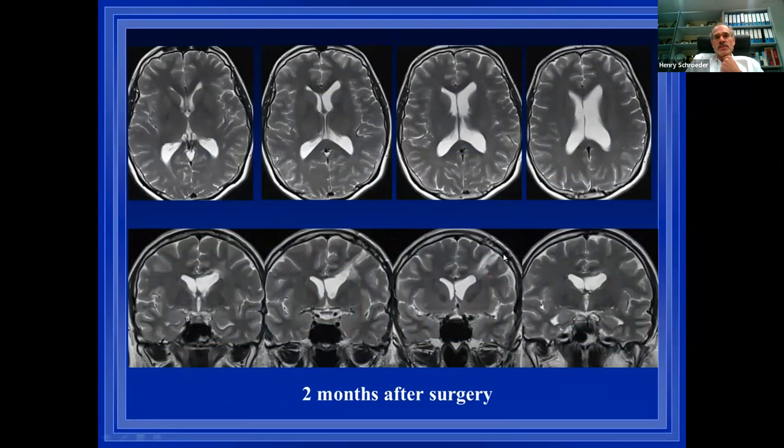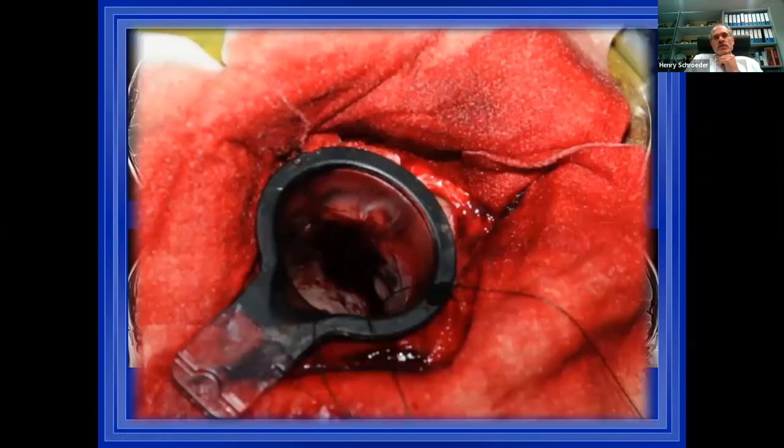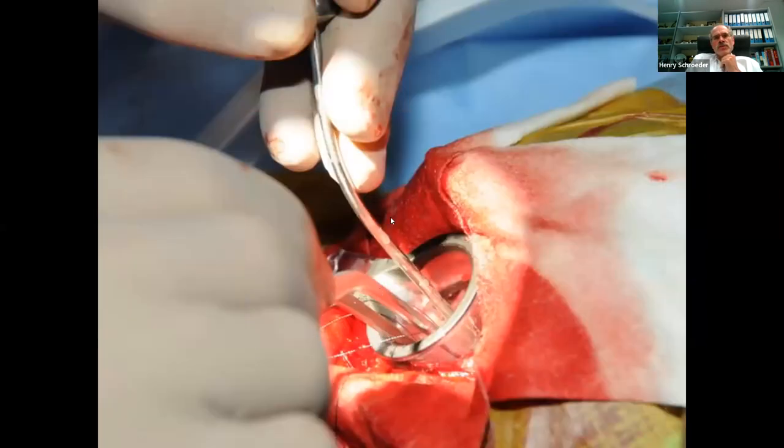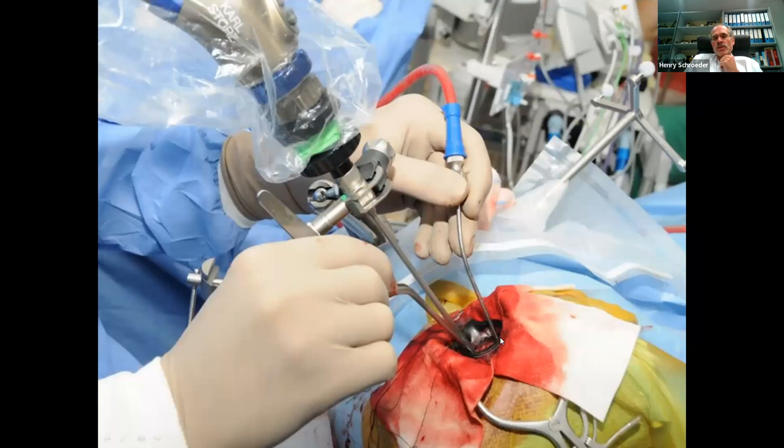And you see, this is a tract. So it's not too much damage. So I think the use of a tube in cases where your surgery is not very effective is a good alternative. You can use it under the microscope. Then you don't have anything inside here. But of course, you can also take an endoscope and work in this area.